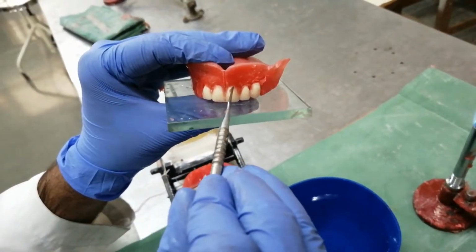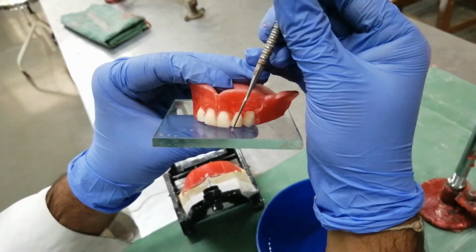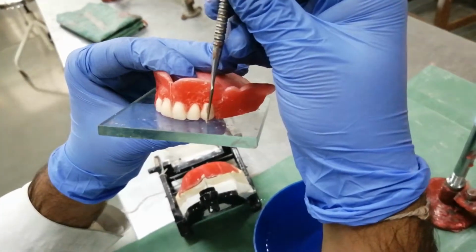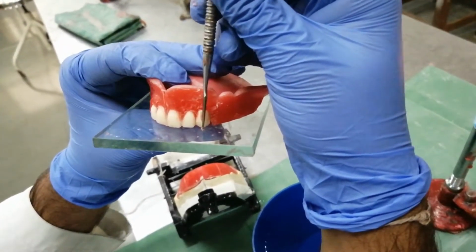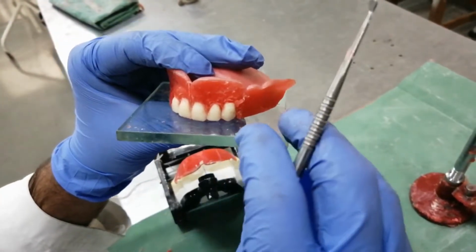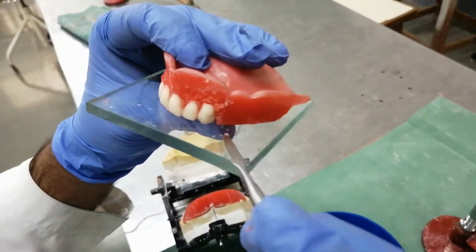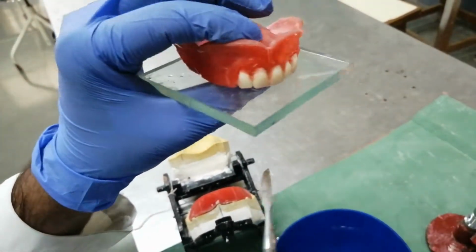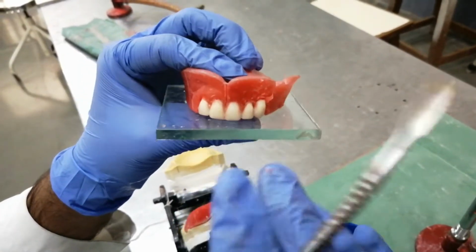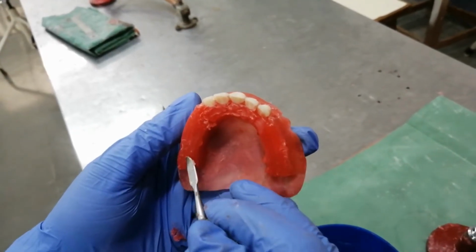Midline, long axis. Long axis slope towards the mesial aspect. Long axis is almost straight. Neck of the canine is prominent. Tip of the canine should touch the glass slab. Remaining occlusal rim should touch the glass slab. Incisal edges should touch the glass slab. Incisal edges are following the arch form.